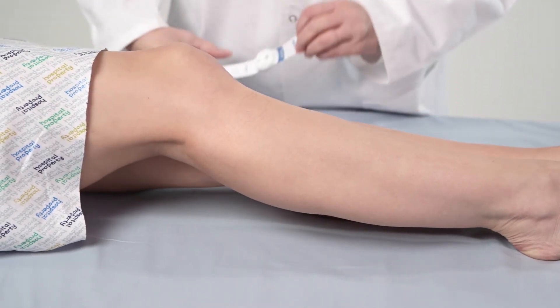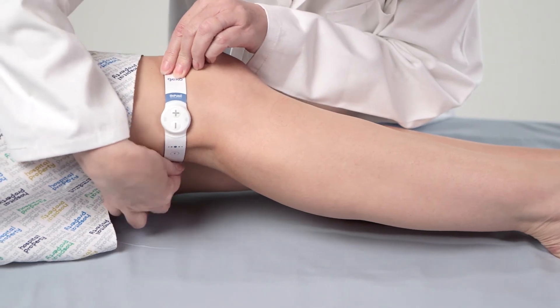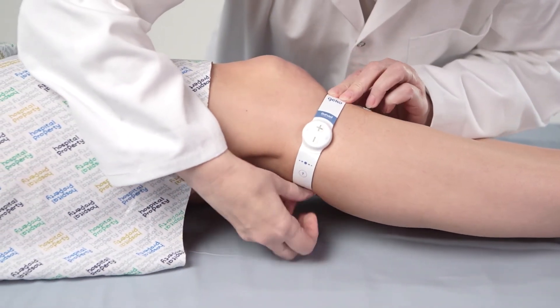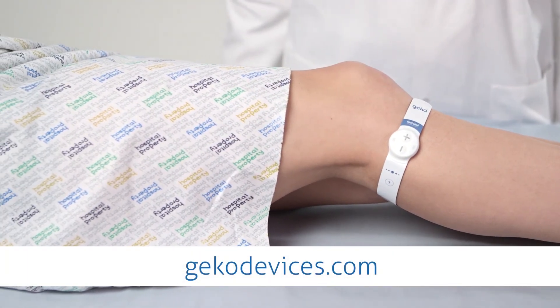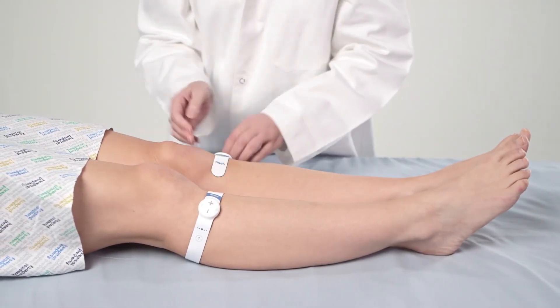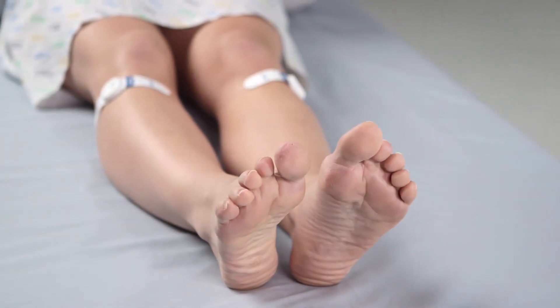If the primary location does not produce movement of the muscles, stimulation may be achieved using the alternative fitting locations, slightly above or below the crease at the back of the knee, with the location marker aligned to the outer lateral collateral tendon. See gekodevices.com for further details. For VTE prevention, fit the geko device to both legs. For the treatment and prevention of edema, fit the geko device to the affected leg.